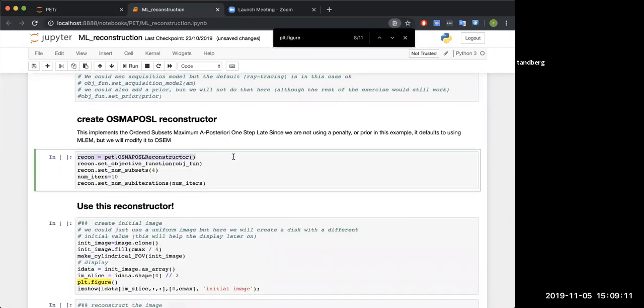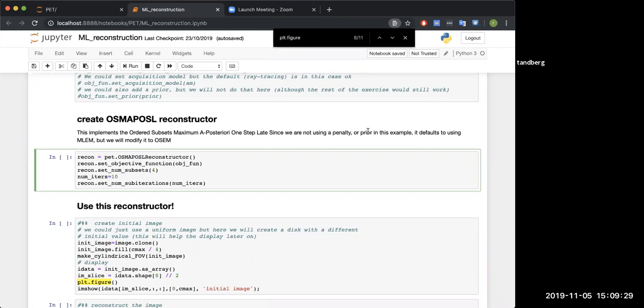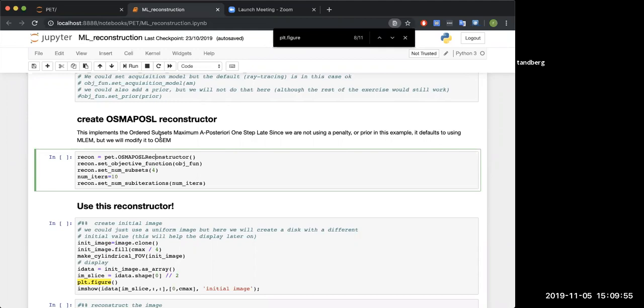Now we're getting into some reconstructions. Create me an objective function, and it's going to be the Poisson log likelihood. We tend to say it's a Poisson distribution in PET, so we're going to try and maximize the Poisson log likelihood. You could in theory add in a prior, but we'll get into that in later examples. Now create me a reconstruction object. It's going to be ordered subset MAP, one step late reconstruction. But as you'll see above, if you don't use a penalty or a prior, this simplifies down to OSEM.